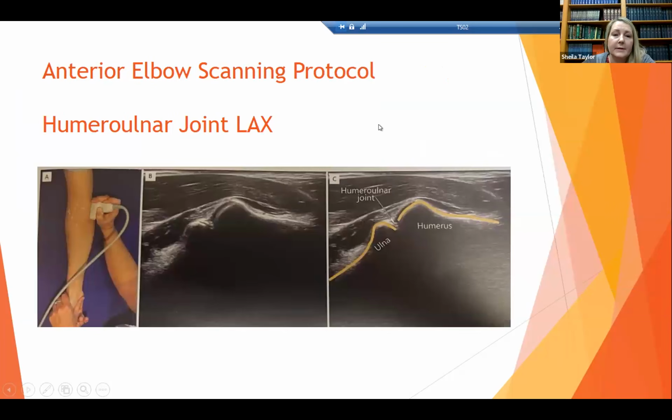And then to look at the joints. So during my case, I do this complete diagnostic ultrasound, but I don't often save a ton of these images just because that clogs up our imaging. But I will look at all these structures.